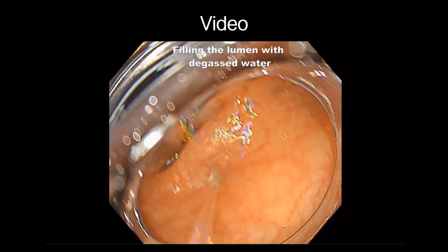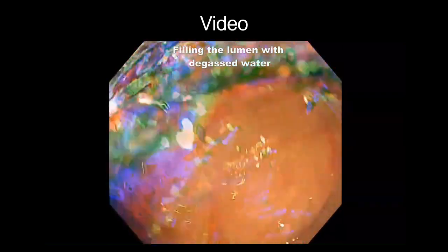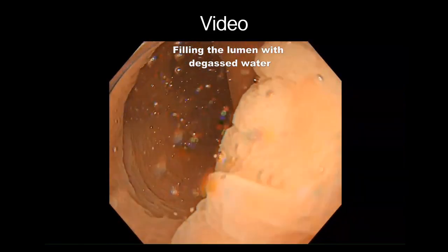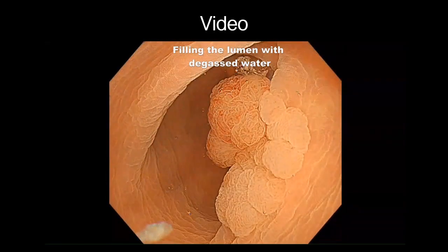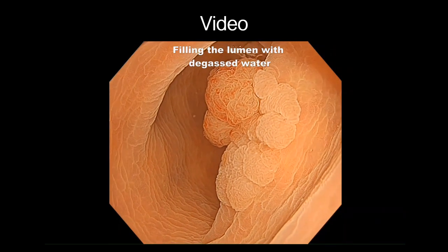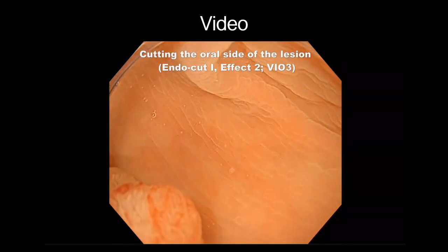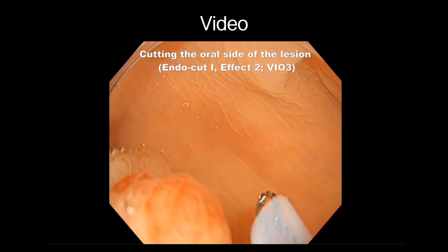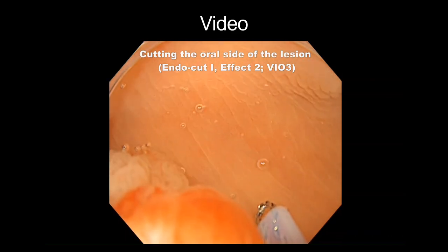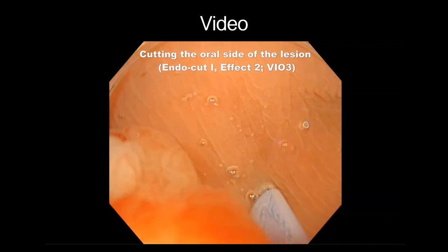Degassed water was infused using a mechanical water pump to completely fill the lumen. A mucosal incision was then made on the oral side of the lesion using a cutting current.